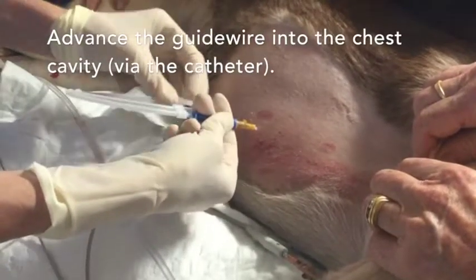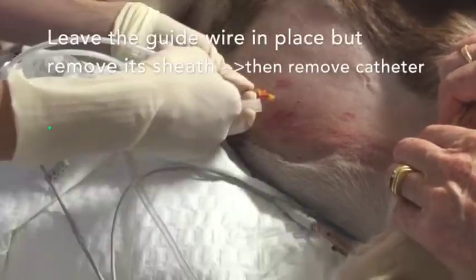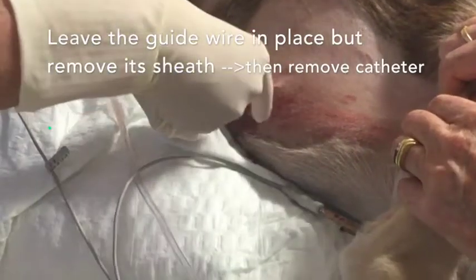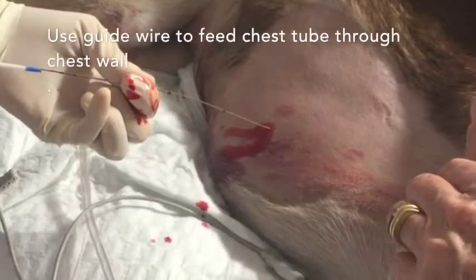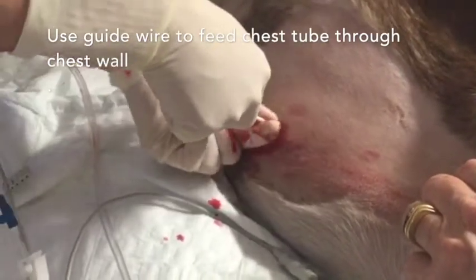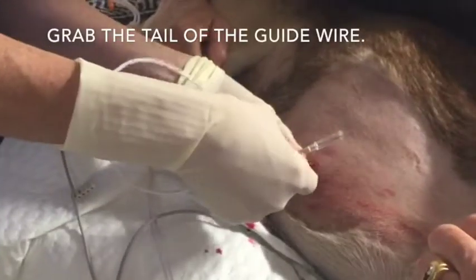Then advance the guide wire through the catheter into the chest cavity. Leave plenty of guide wire outside of the chest cavity and don't let go of the guide wire, but remove the introducing catheter. Don't let go of the guide wire, but use it to feed the chest tube through the chest wall.